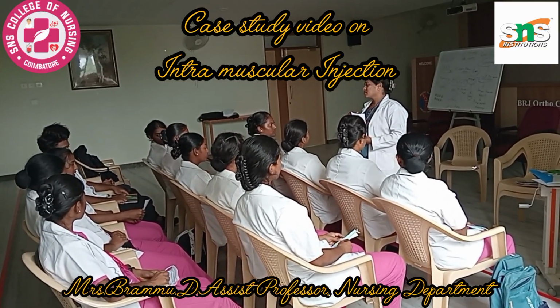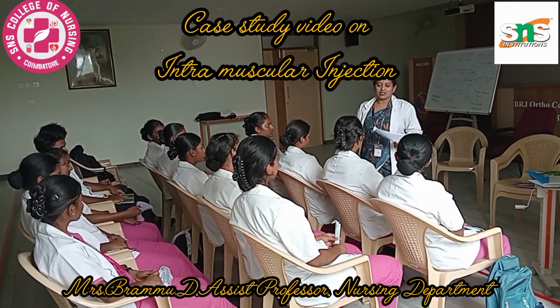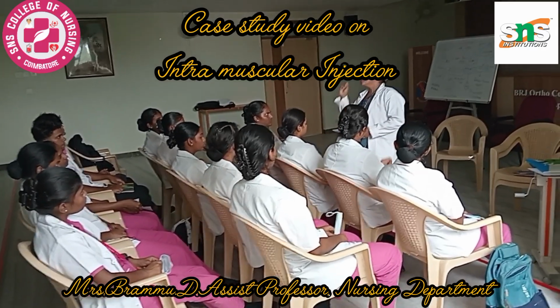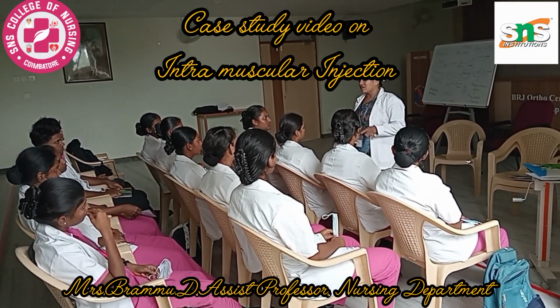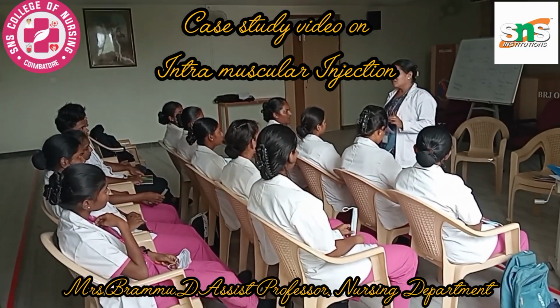Patient comfort, wash hands, record. Comfort the patient, reassure the patient, and take all the articles to the nurse's station, wash hands, and record. Documentation is very essential. So by now you are clear with how to do an intramuscular injection, right? Are there any doubts?